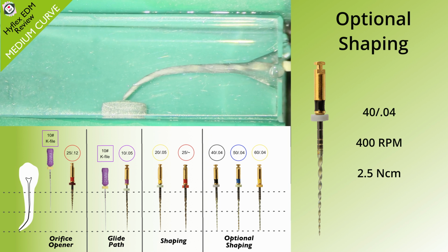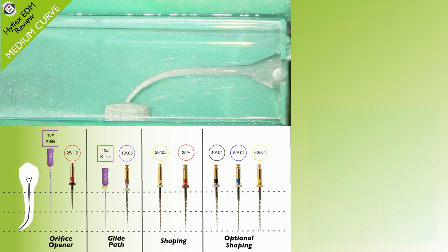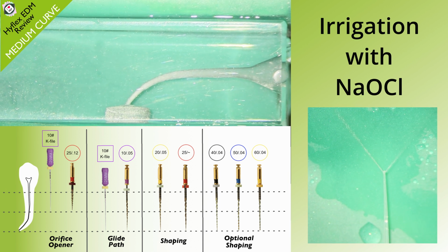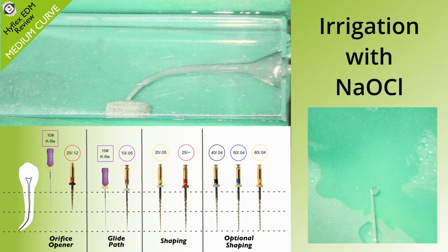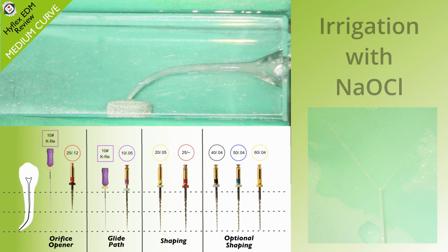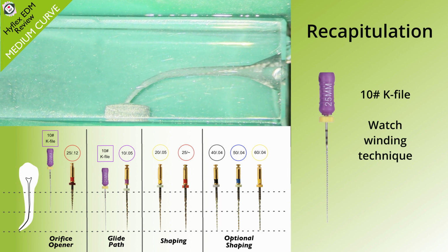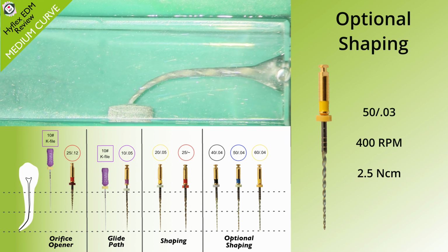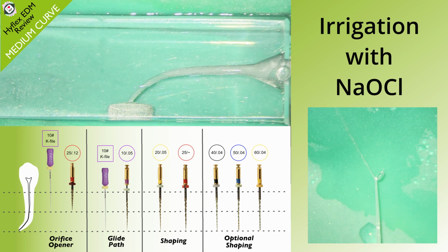And as mentioned with the simple file case, at this point you would probably stop. But I just wanted to see how well the optional shaping files would fare in a medium curve, and this is the 40.04 shaping file. Again, irrigation. Fantastic, the Hyflex tips. And recapitulation.